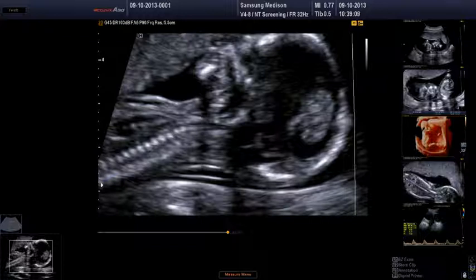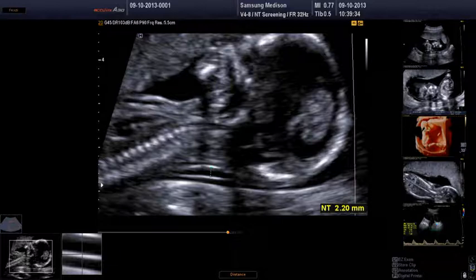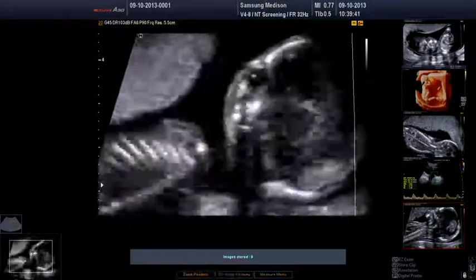So we're just going to measure the nuchal translucency here, and you can see the echogenic line that is the boundary of nuchal translucency, both anteriorly here and posteriorly. Ideally, we want to place the caliper on the bright echo edge rather than in the grey area. So that's one caliper there. This is the second caliper down here. And that would be a very normal measurement, 2.2 millimeters for this fetus. That's great.